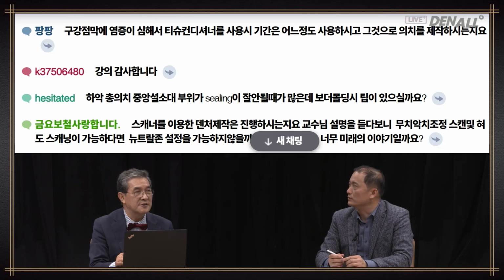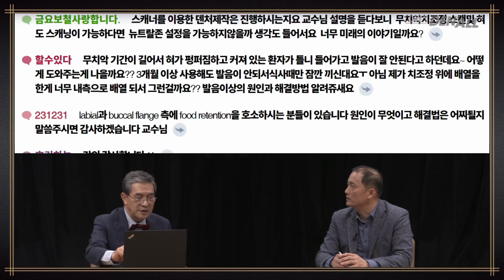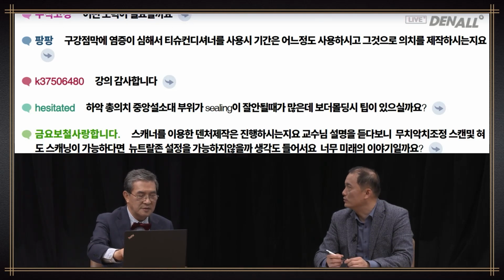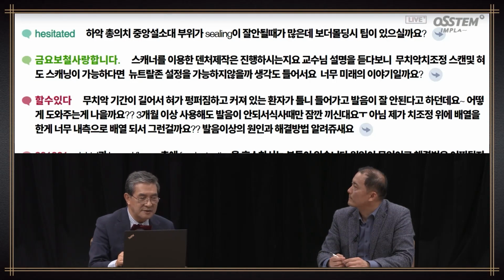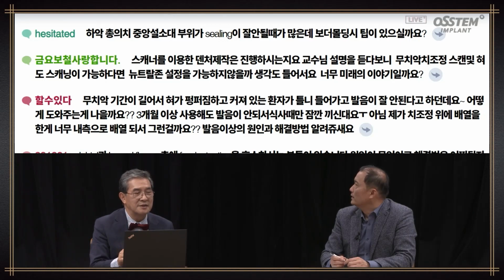Well, the inflammation pain goes away within a week usually, but if there's a laceration or serious cases, in other words, then about a month is something that you have to keep following up. And then another question says, for a lower full denture when the median area does not seal well, any tips for the border molding? So yes, the midline or the central area, I think, is what he's talking about.